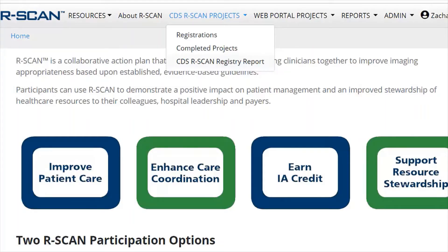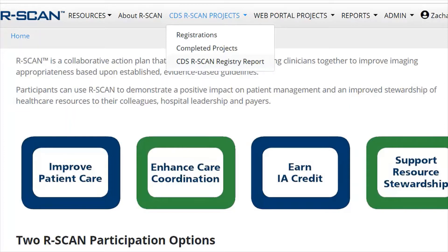The first step to starting an R-Scan project is to review the CDS R-Scan Registry report to identify imaging areas for which there is an opportunity to improve the ordering of high-value imaging exams. Log in to the R-Scan workspace and click CDS R-Scan projects from the main menu and select CDS R-Scan Registry report.